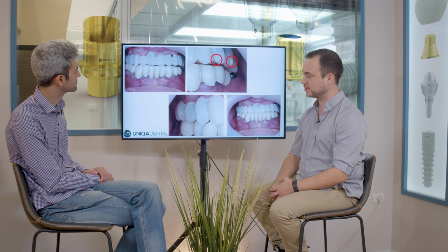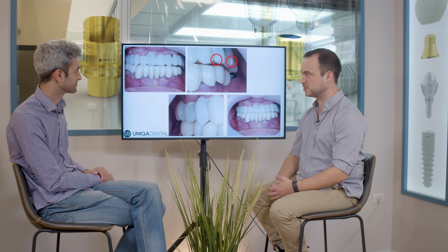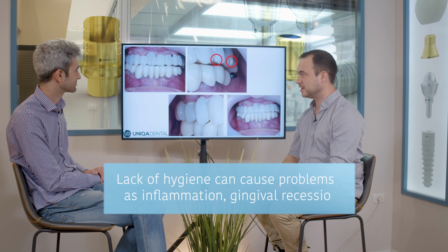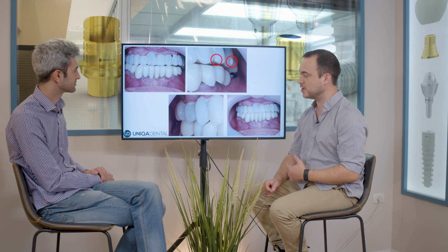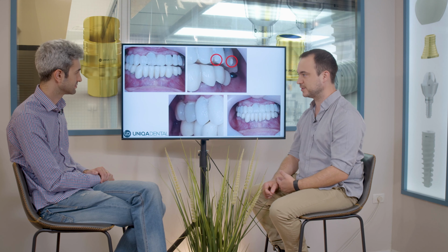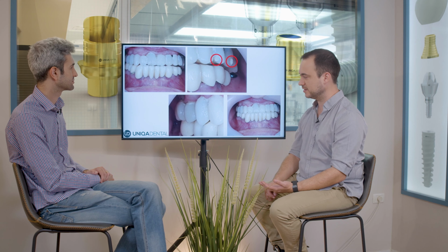After 4 months, you can see she came with a bridge, and you can see the main reason why her teeth were extracted in the first place. You can see that there is almost no hygiene at all. You can see all the plaque around the crowns. You can see inflammation around the crowns. It's not what I want to see after 4 months, after the healing process was done. I want to see clean crowns.